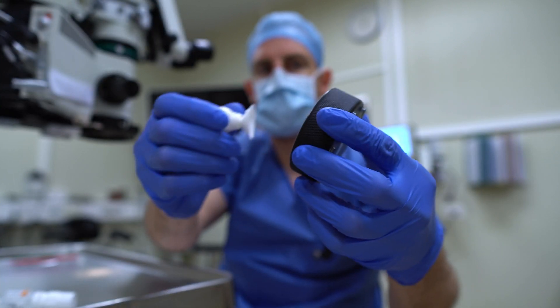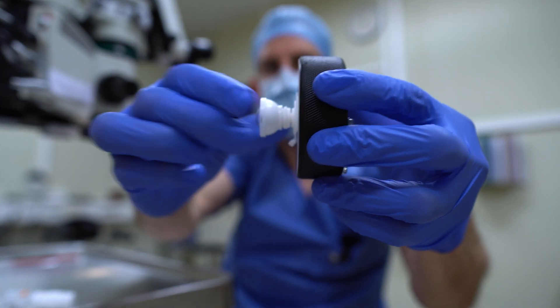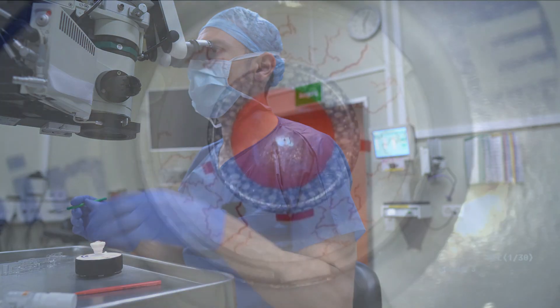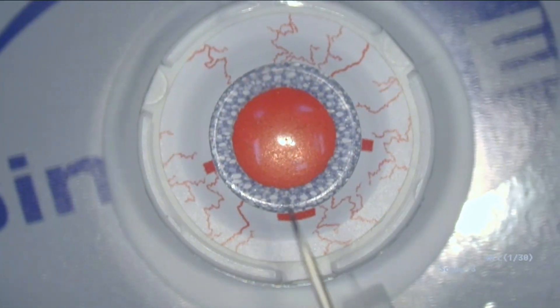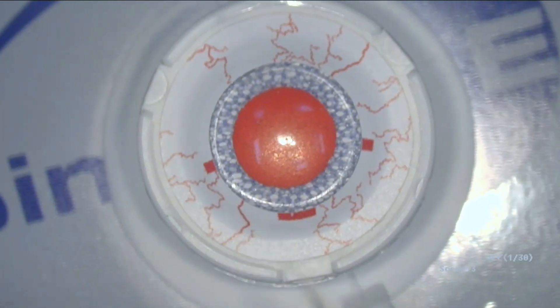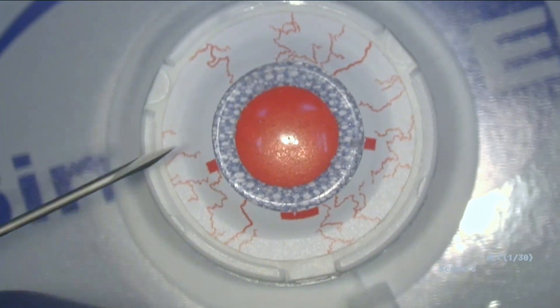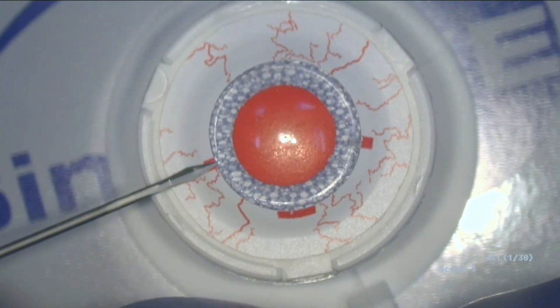Let's see how this goes — you just push this on here and it sticks. Under the microscope you have these different markings: this is for your main incision and these are your paracentesis. This is pretty sticky — not sure if it's my knife or if the material is too sticky.